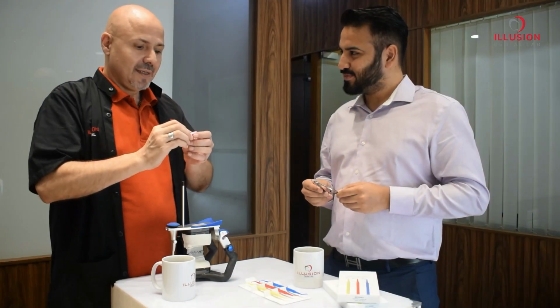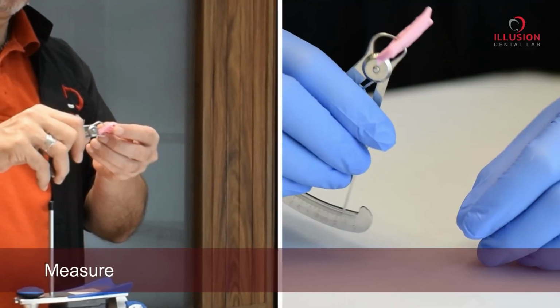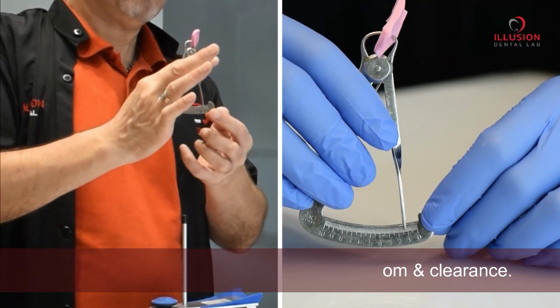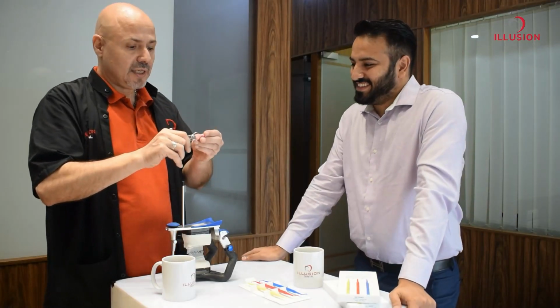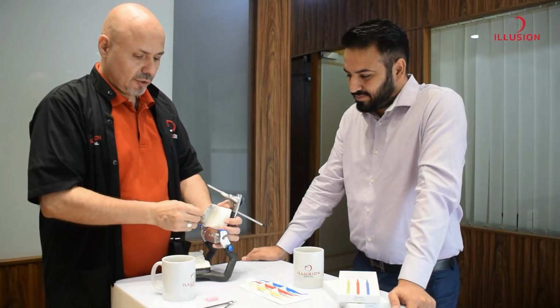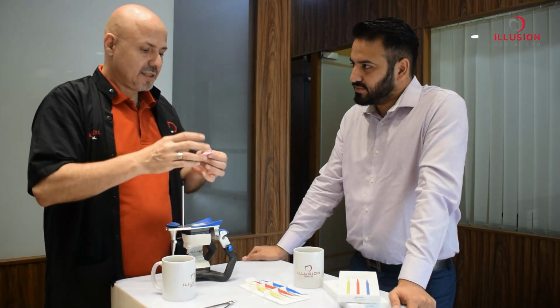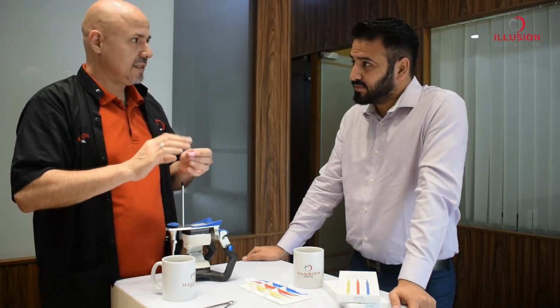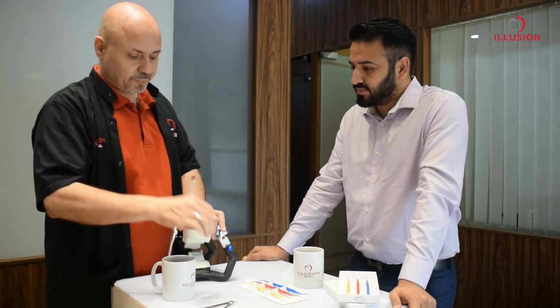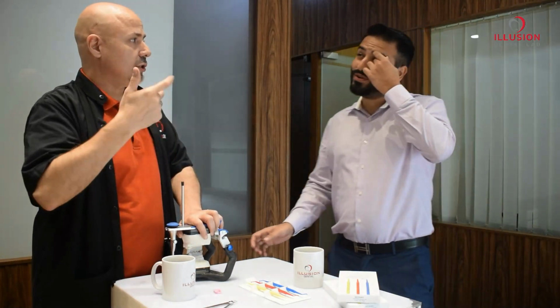First take the bite, then with this nice veneer caliper you can measure your bite and see if you really have adequate clearance. And once you see, here I need a little bit more preparation, you can do the corrections. Once everything is settled and you have the required minimum of 1 millimeter, which is the standard we basically need for most of the materials, then you proceed to the impression or the intraoral scan.